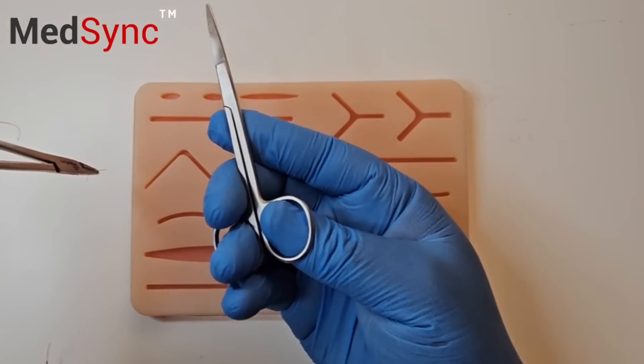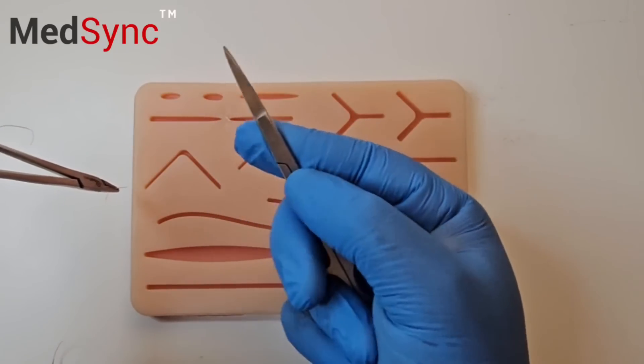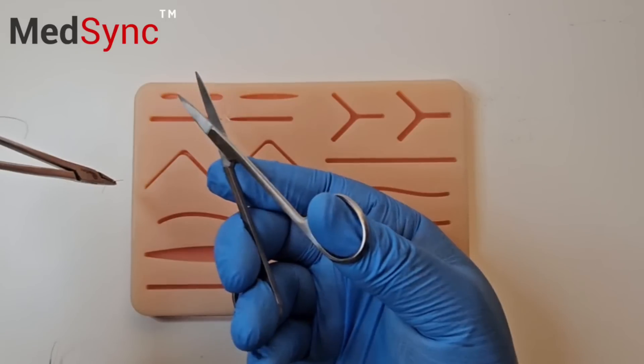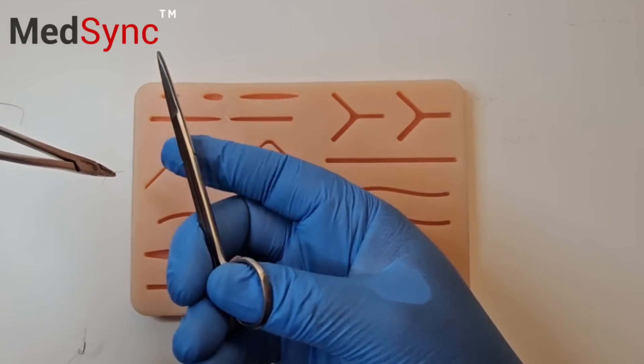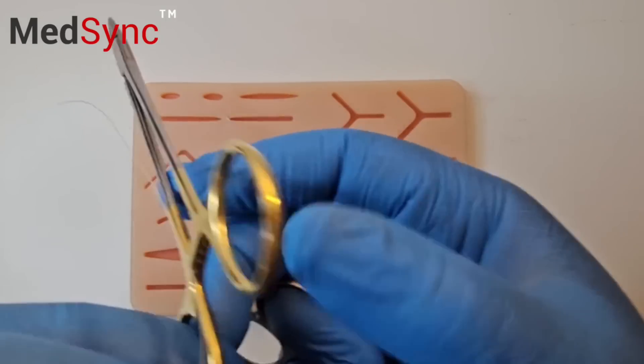Here's the bonus trick: you flip the scissor out, mount and you cut. With your index finger, push the scissor back down.